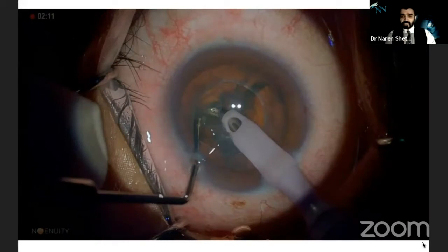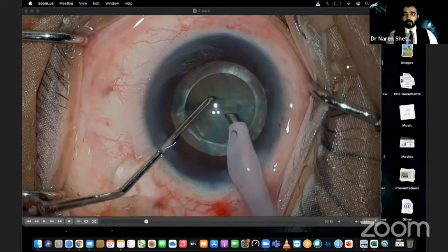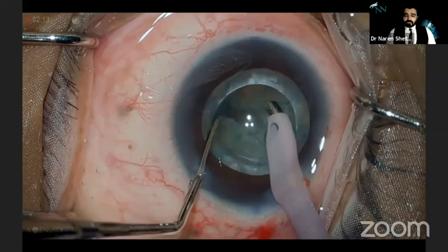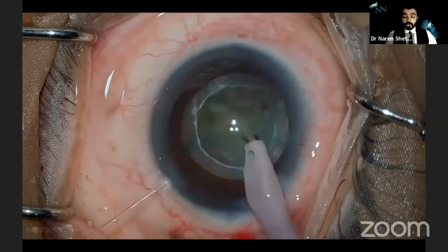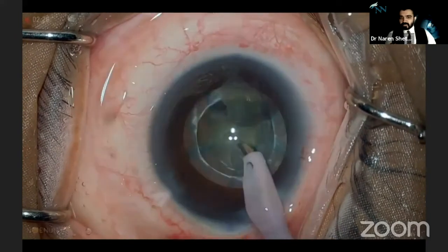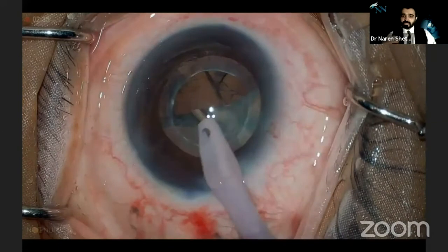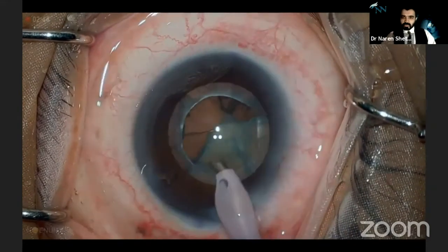Now looking at an NS2 grade cataract, chopping is much easier. A tip when doing chops: once you have a good hold on the lens, do not move your tip, as there is a high chance of causing iatrogenic zonular breaks. Also, do not press too much phaco power — you can see the piece chattering rather than disappearing cleanly. The right amount of power is very important; more power does not mean a faster cataract surgery.